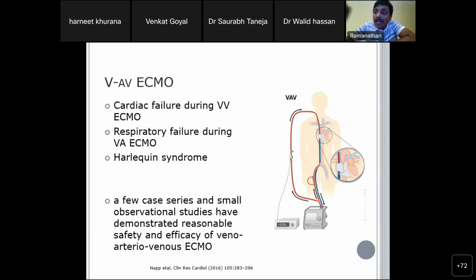Mind you, when we talk about hybrid ECMO, the literature surrounding hybrid ECMO is only limited to case series and small observational studies. All these studies have shown that hybrid ECMO is more challenging, has more complications, and outcomes from hybrid ECMO are poor compared to default ECMO modes. So compared to veno-venous ECMO or veno-arterial ECMO, hybrid ECMO has a higher morbidity and mortality. Hence, hybrid ECMO is not a default mode.